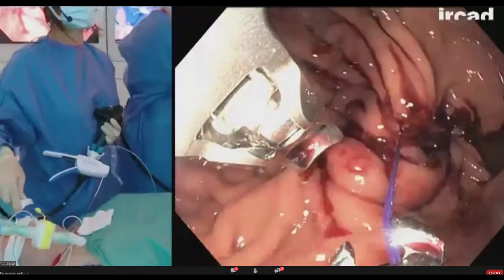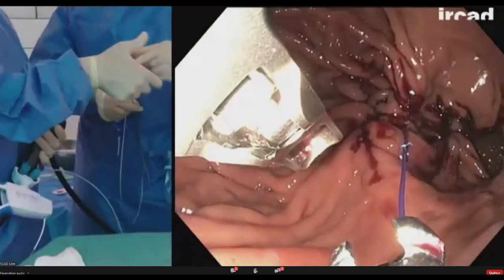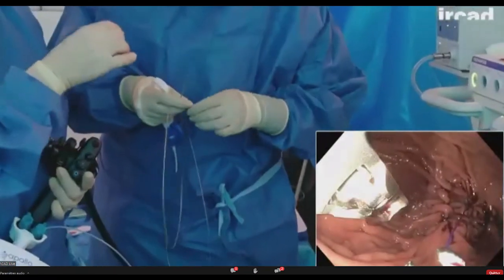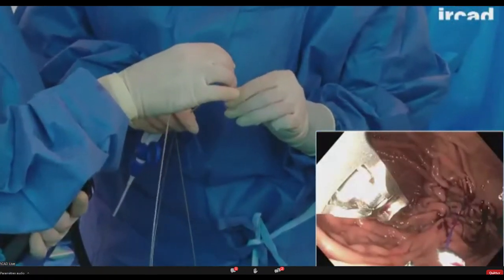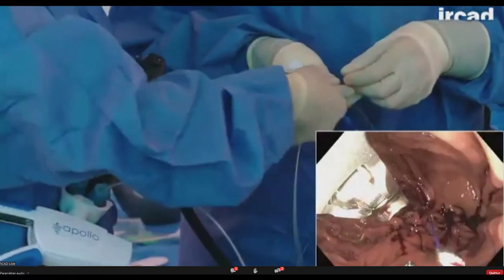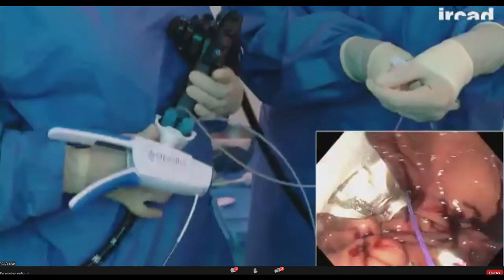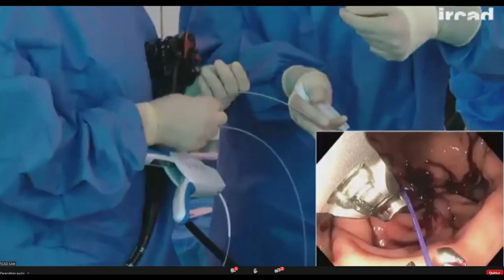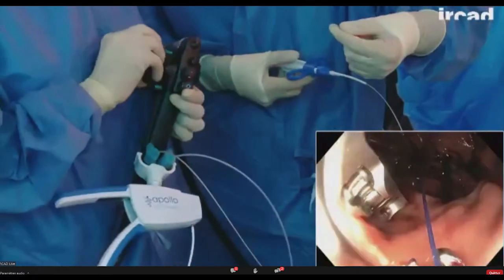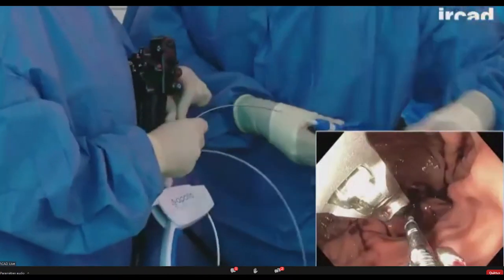My impression, we have done about 200 cases so far here, is that it doesn't really make a difference once you're over the learning curve, because the more of this procedure you do, the better you place your stitches. It doesn't mean that you place more stitches, it means that your actual bite is more accurate in terms of thickness and depth of penetration. But I know that Abu Dhabi is doing a study that is not ended yet, and they seem to have slightly better results with reinforcement. Correct me if I'm wrong, Manuel. Yeah, it's an FDA trial, an RCT, and we're going to have the first results by the end of the year.